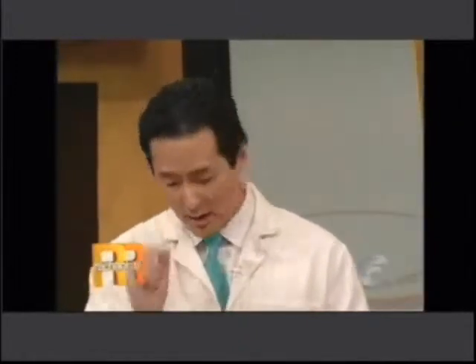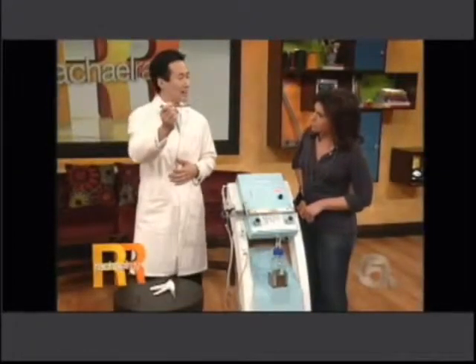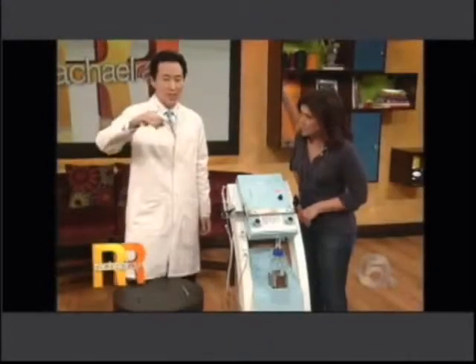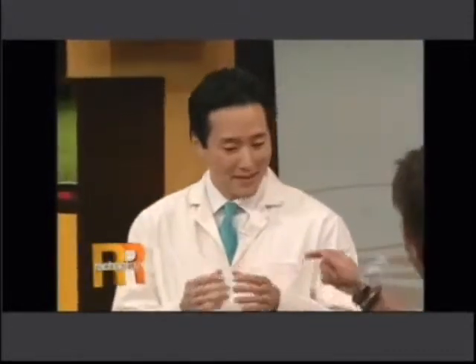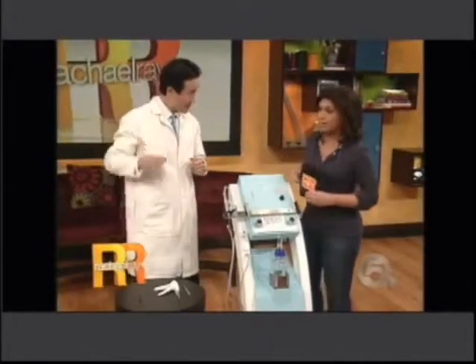So a traditional hair transplant surgery entails 5 steps. First step is, as a surgeon, I would take a big scalpel like this and literally cut a strip of skin off the back of a person's head. Okay? Second step is I would take a stapler like this, a staple gun, and staple that scalp back together. Are you serious? Yes. You just take a staple gun and staple the person's head back together, Frankenstein-ish type of thing.